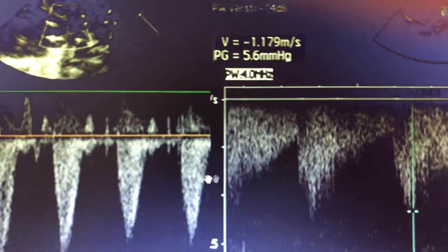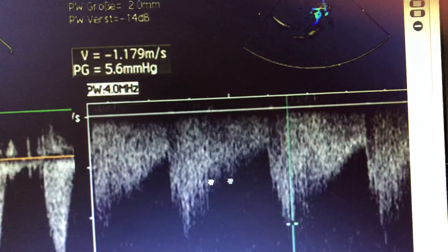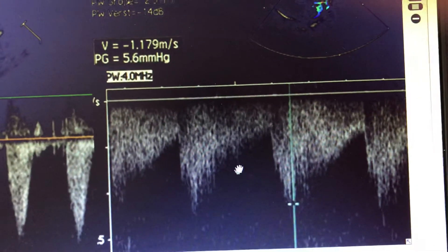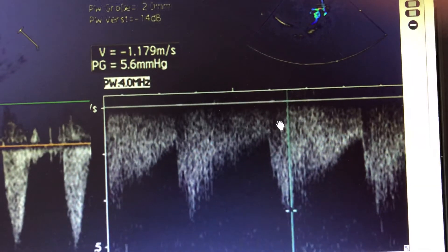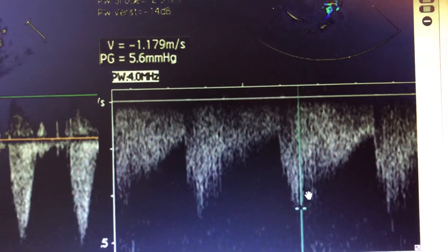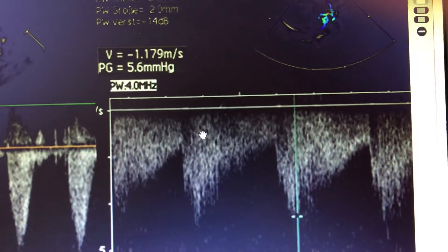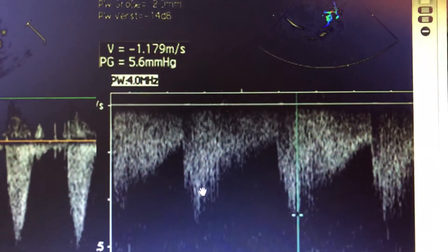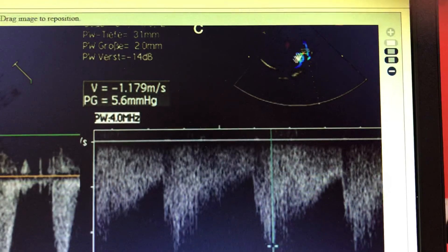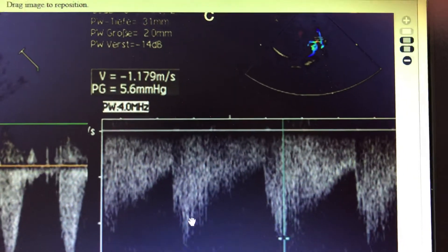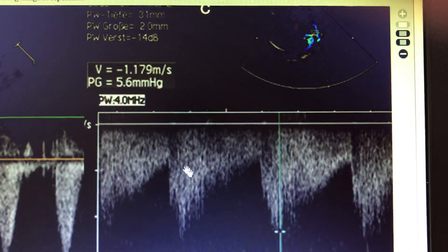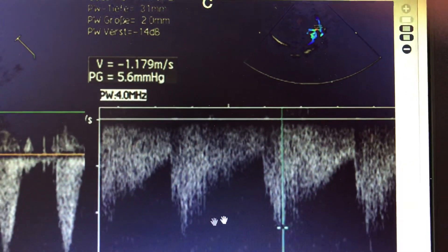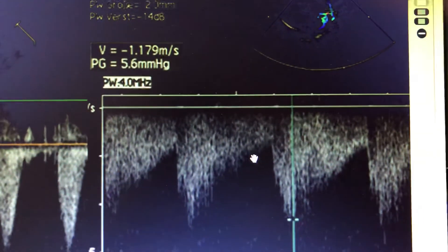Most probably it is immediately after birth. This is also a similar Doppler being seen, but here you can see that there is continuous flow below the baseline. There is flow in systole which is much more than in diastole, but blood flow from right to left is occurring even in diastole. This represents a continuous right-to-left shunt, which is very very rarely seen.